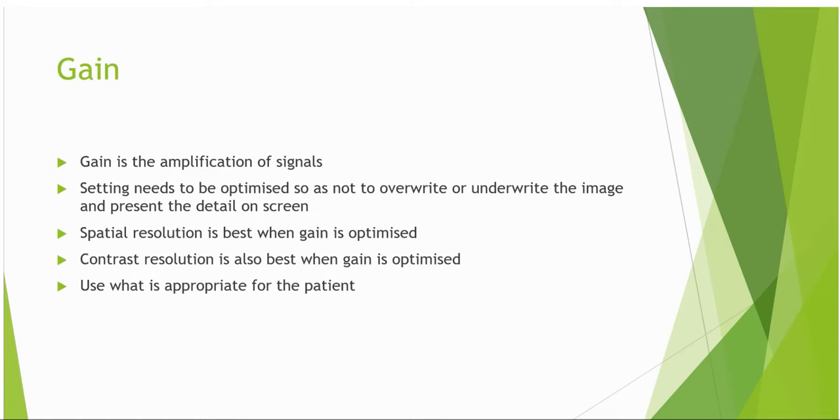Over the years, I've heard sonographers try and educate others that gain setting should not go above or below a certain value. This statement is not correct. Gain should be applied to whatever value makes the image acceptable. When dialing the gain, we need to take note of the setting, but we do not let the value direct us.